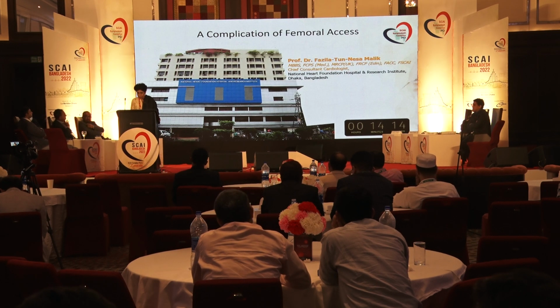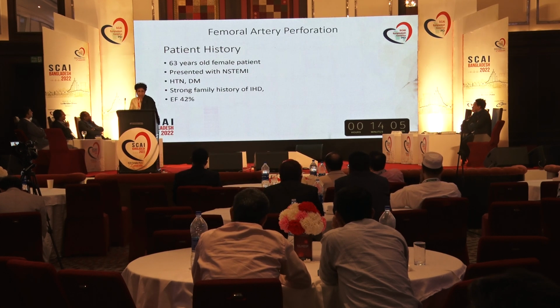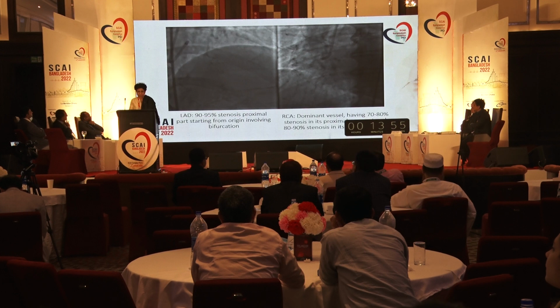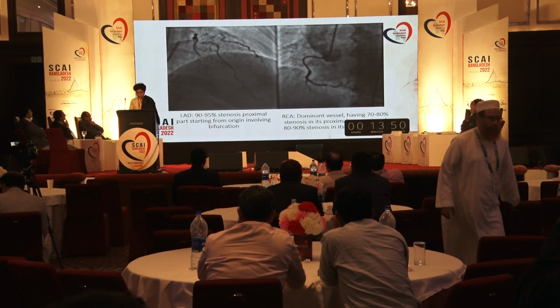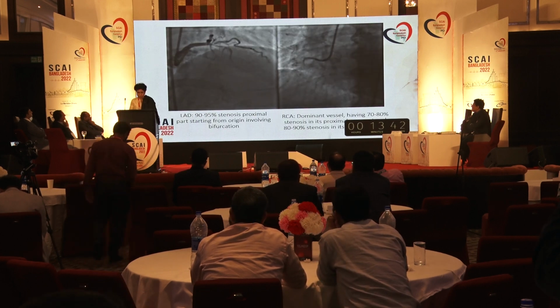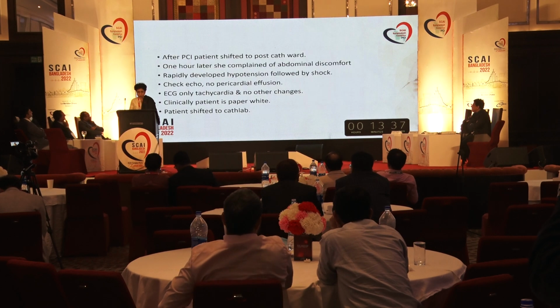So with that, I would like to show you a case that happened quite a few years back. This is a 63-year-old female patient who came to us with non-STEMI, and her ejection fraction was 42. As you can see, there's nothing really complex about the case. She had a 90 to 95% LAD stenosis. She had an RCA dominant vessel with a 70 to 80% stenosis in the proximal part, and an 80 to 90% stenosis in the distal part. We did the angioplasty, and the final result was acceptable.